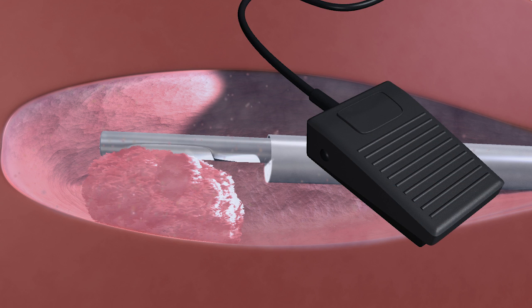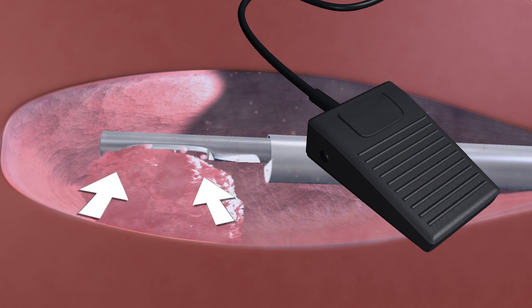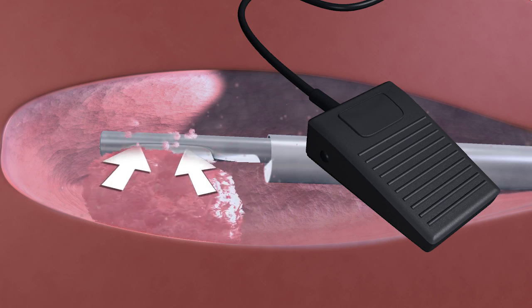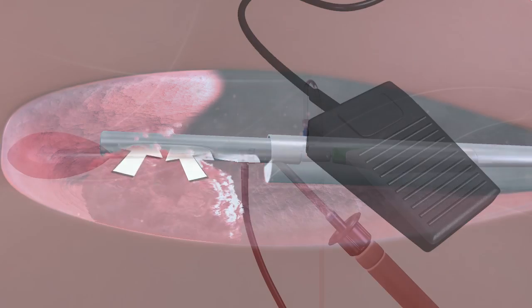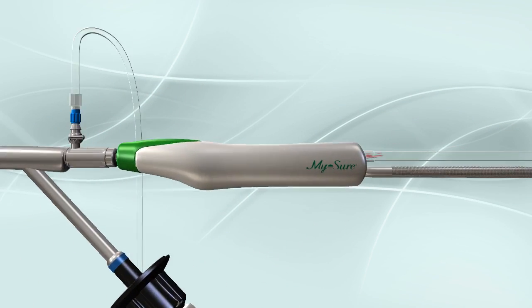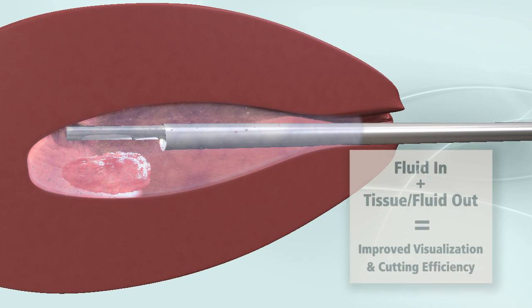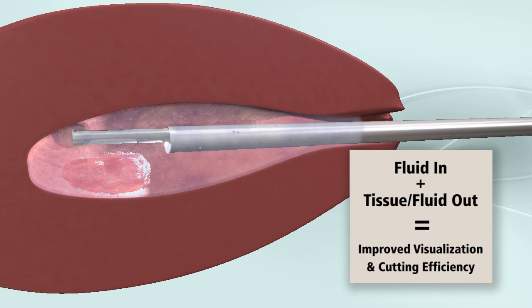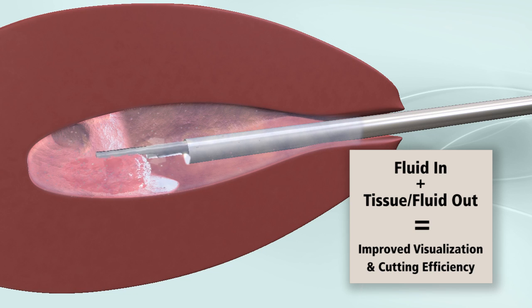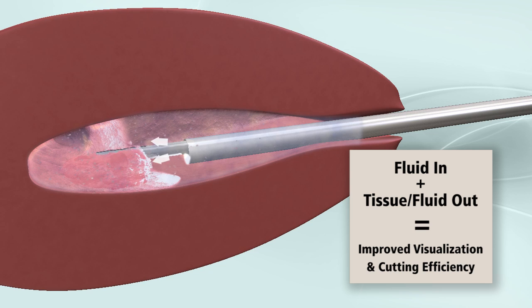When the Myosure foot pedal is activated, the cutting window is opened and suction pulls fluid and tissue from the uterine cavity through the Myosure device and into the tissue trap. To maintain distention while suction is activated, infusion of fluid into the uterus must be at a fluid flow rate and pressure to establish a balance between the two.